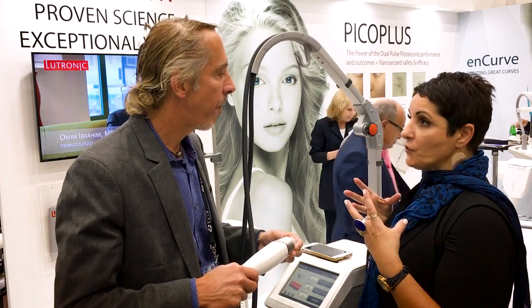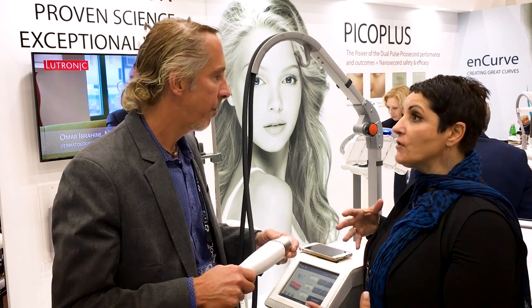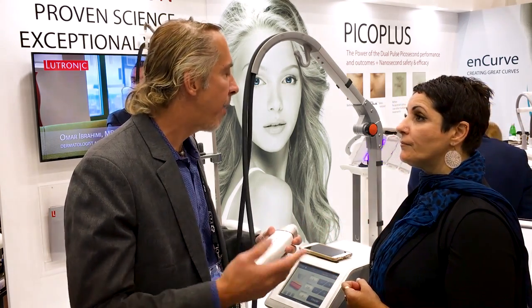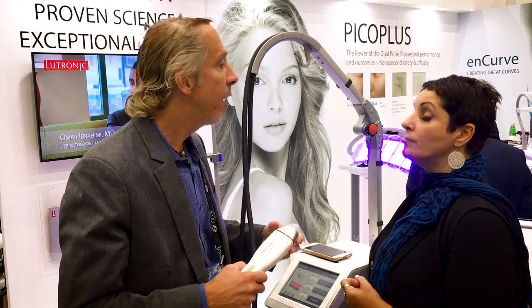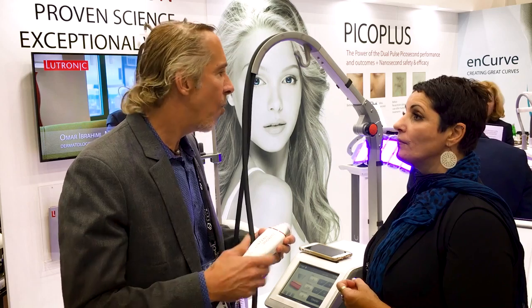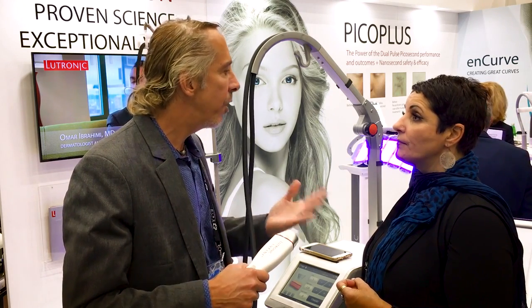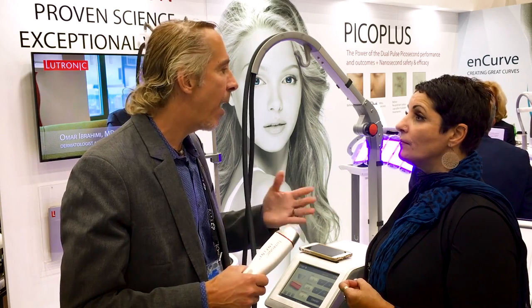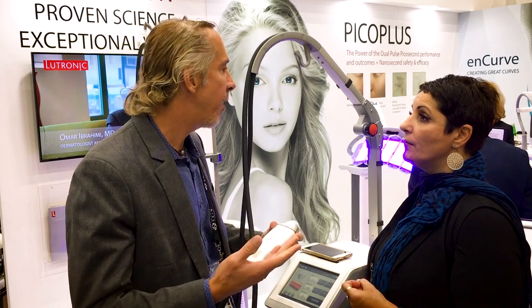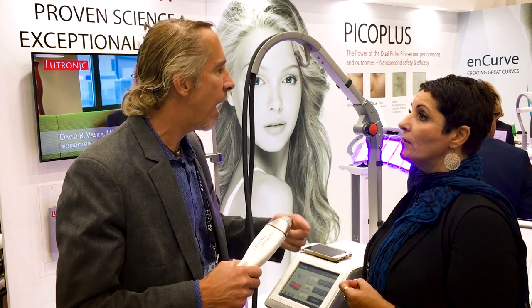So you said a treatment takes 25 to 35 minutes. Is it a one-off treatment, or is it something that you should do in a series over a certain time to get the best results? Well, that varies upon the problem that we're trying to treat. If you're doing prevention in your 20s or 30s, one is probably good enough. But if you really need correction, usually we recommend 3, separated by about a month apart. And your results should last for 2 to 3 years. Maybe have a touch-up every year, year and a half.